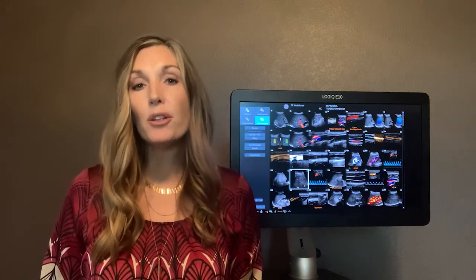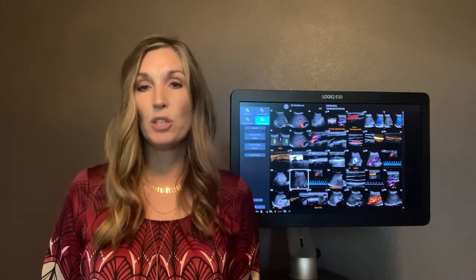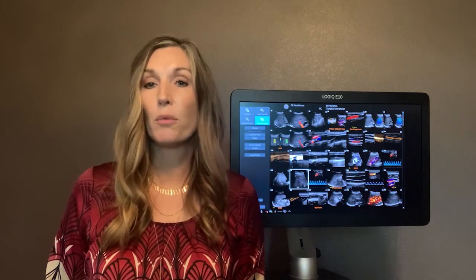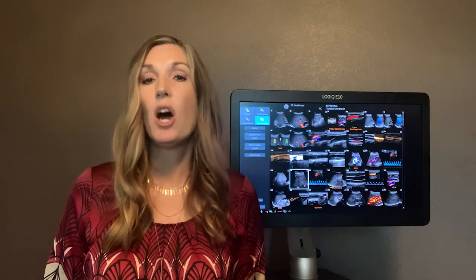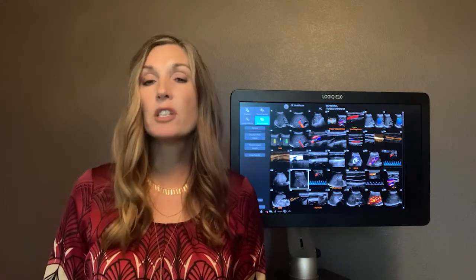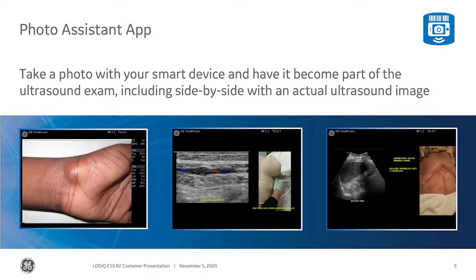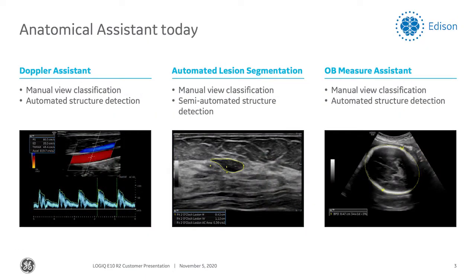Powered by Edison, our new AI-based workflow tools help increase exam efficiency. The A-to-A digital platform, or Awareness to Assistant, harnesses the power of artificial intelligence, enabling patients to use smart devices for our Photo Assistant and remote-controlled app. Anatomical Assistant uses machine learning to provide anatomically-based assistance to the user for enhanced workflow.